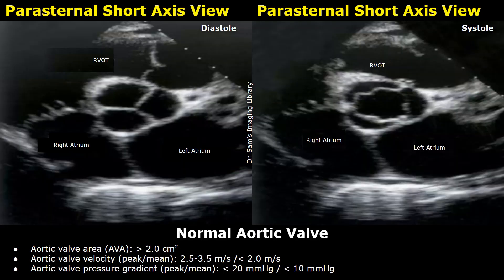These are parasternal short axis views showing the normal aortic valve during diastole and systole. The three cusps can be noted. This is how the valve appears during the cardiac cycle.